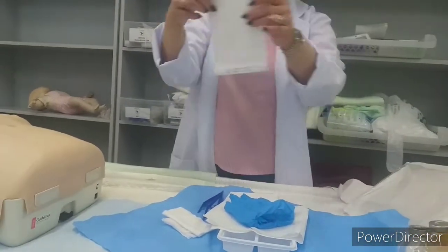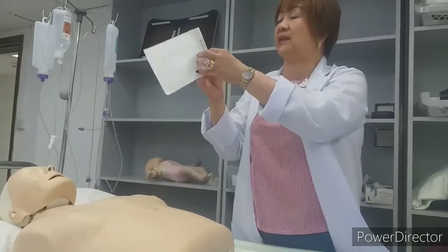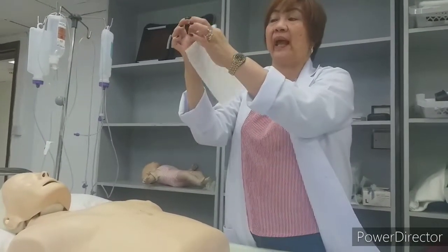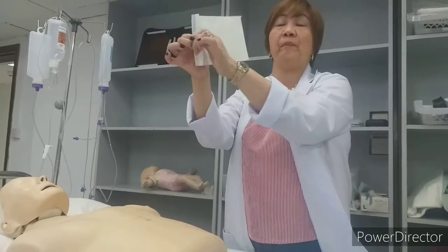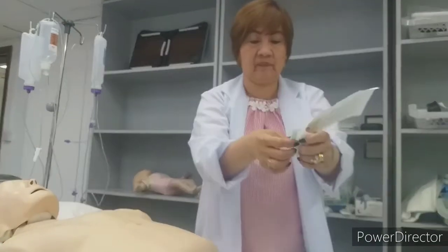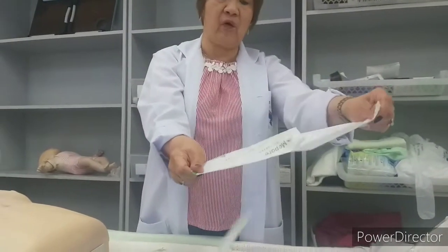Get your adhesive plaster, or we call it the bigger version of your Band-Aid. So, anything you have to open on top, let it fall.